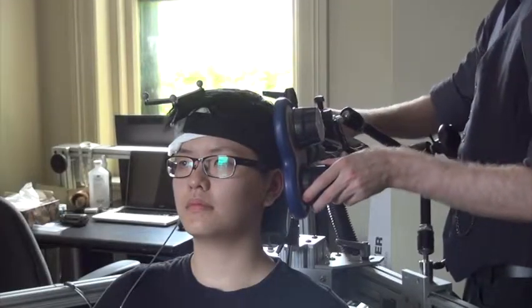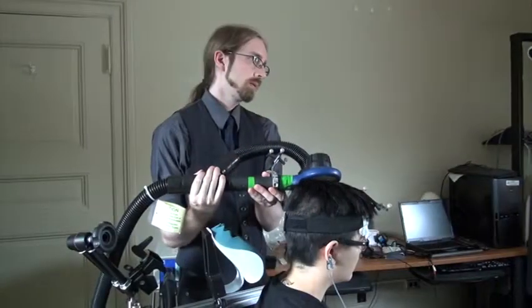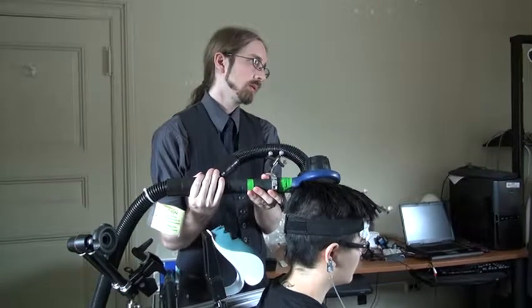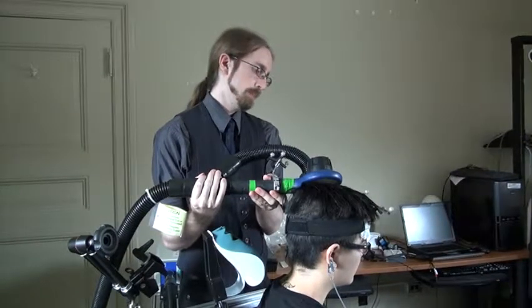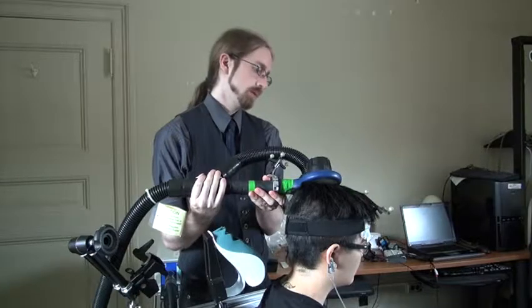When the stimulator coil is held against a participant's head, the magnetic pulses emitted can cause a temporary increase or decrease in the activity of the brain region directly underneath.